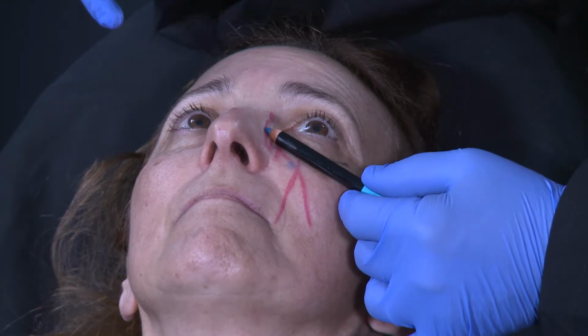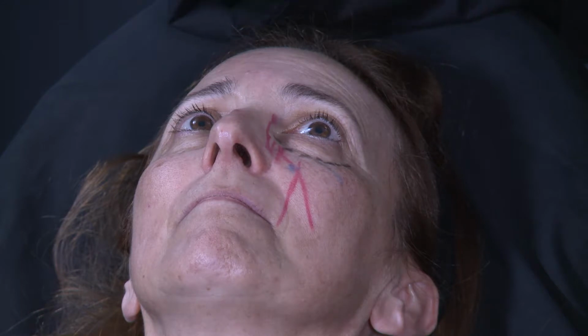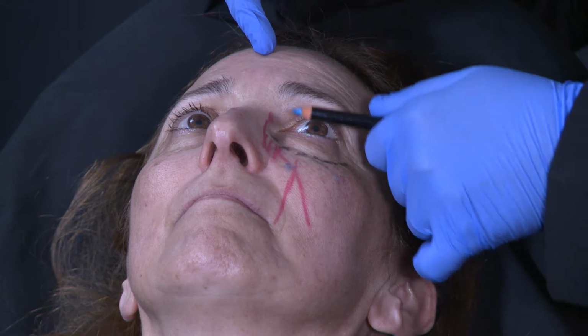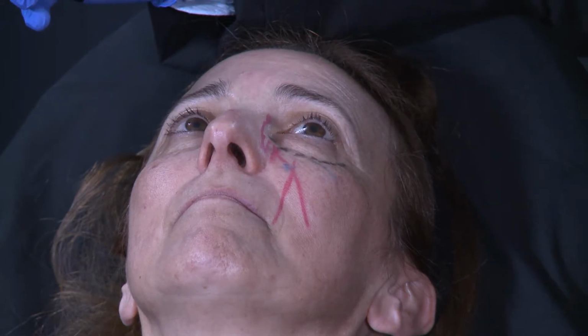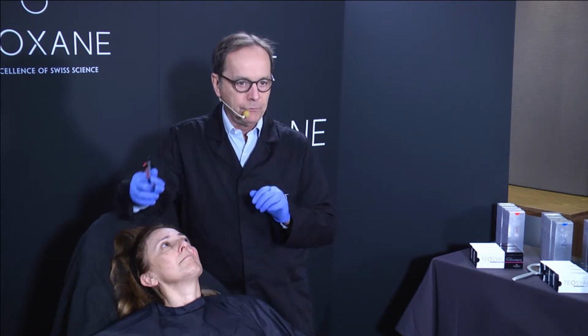So which product do I use? I use Redensity 2. This is the only product that is very specific for the periorbital area. Why? Because it has a low hygroscopic rate. It means that the hydrophilic property of this product is very low. So you will have no swelling when you inject in this area, and you will have no bruising. What you inject will be what will stay.